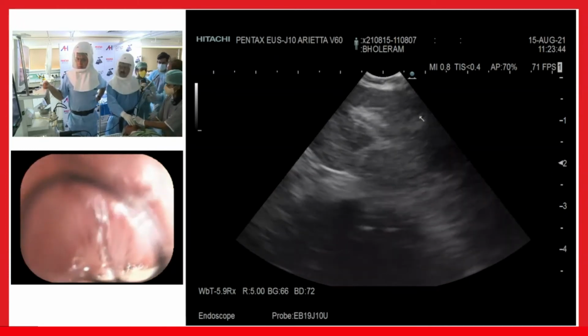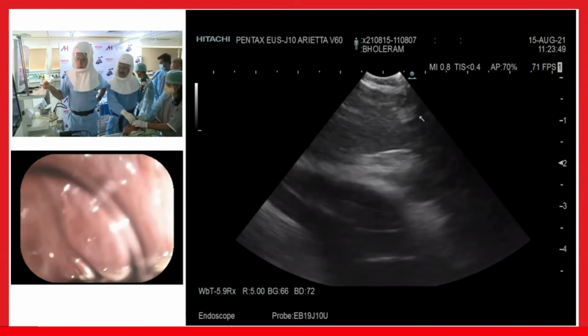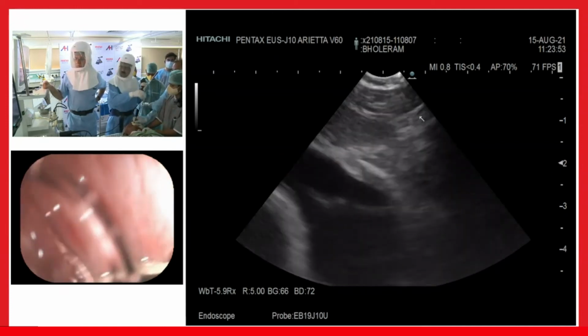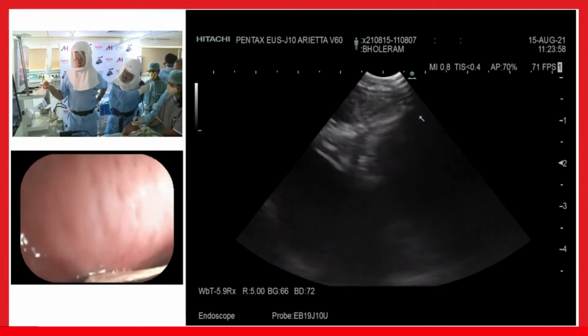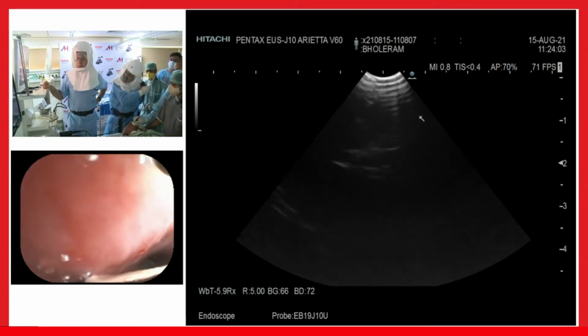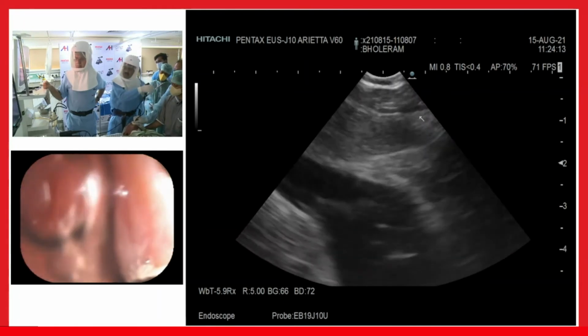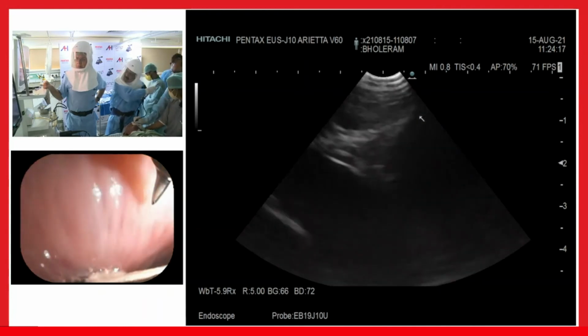It's very important that your assistant should be very good and he should know where the lymph node is, how to hold the scope. Again, the same step. First, look at the tip of the sheath through the endoscopic image of your scope, and then fix the length of the needle and sharpen the needle by taking out the stylet, and then you can puncture.